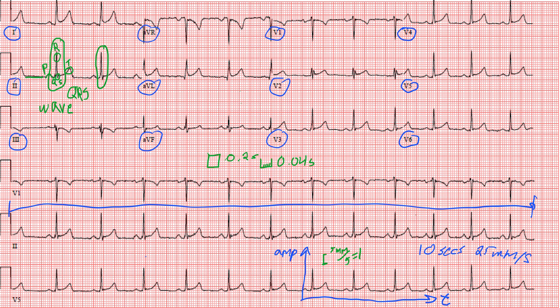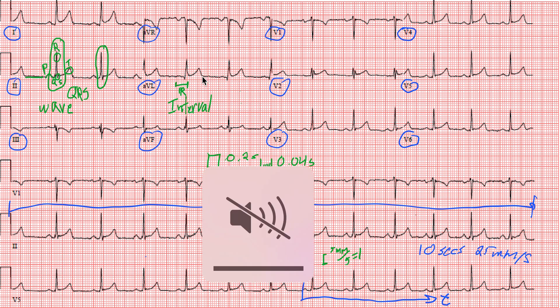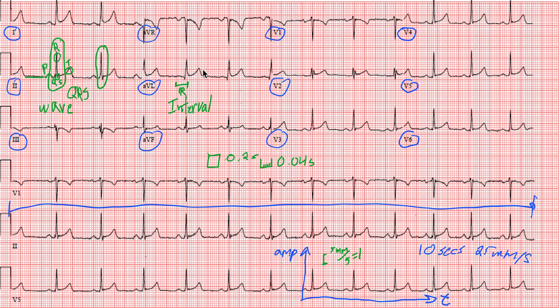The next definition is an interval. An interval is simply the time between two different events or waves. For example, from the start of the P wave all the way to the R wave is known as the PR interval. These are important because they tell you how fast the different parts of the heart are depolarizing. Another interval we often talk about is the QT interval — from the Q wave out to the T wave. In future videos, we'll talk about what these intervals are supposed to look like and what it means when they're short, long, or even absent.